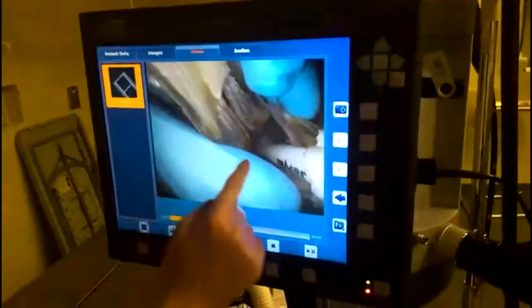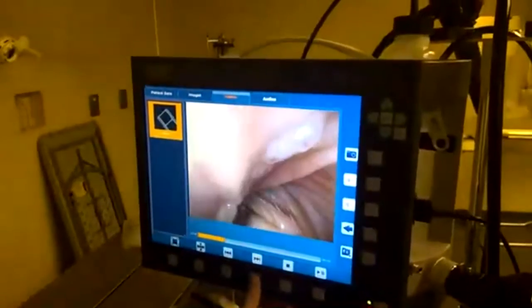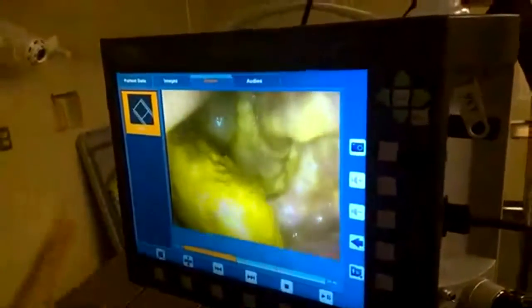So that's a penguin's mouth. You can kind of see we're following, this penguin is intubated, so we have a tube in her throat. And then we're going to go down her throat with the scope, and that'll go into her upper GI. You can kind of see us headed that direction. And then this is some penguin GI that you're seeing here. There's some food bolus there.